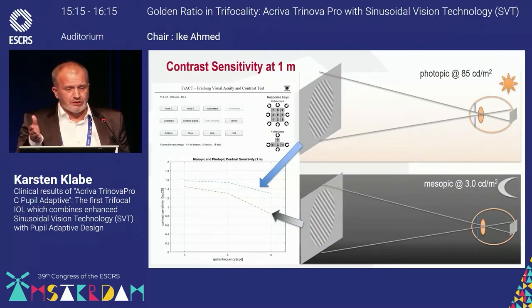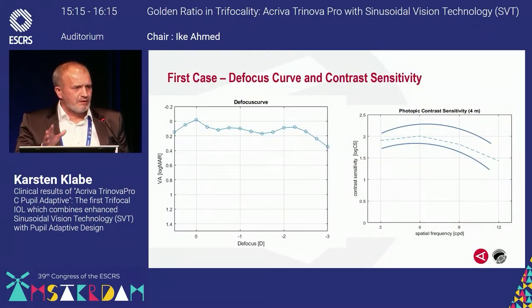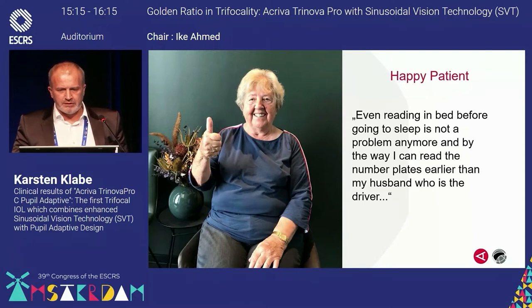The second thing we have to check is the contrast sensitivity. We're using the Freiburg visual acuity and contrast test, which enables us to do contrast sensitivity testing under photopic and mesopic conditions. We can only show you the photopic because it doesn't make any sense to do the mesopic testing before 3 months are gone, but here the photopic testing fits into the normal range, and on the left side the focus curve, which is nearly the same as we see in the theoretically derived defocus curve. And our first patient says even reading in bed before going to sleep is not a problem anymore, and very important, I can read number plates earlier than my husband, and he is a driver.